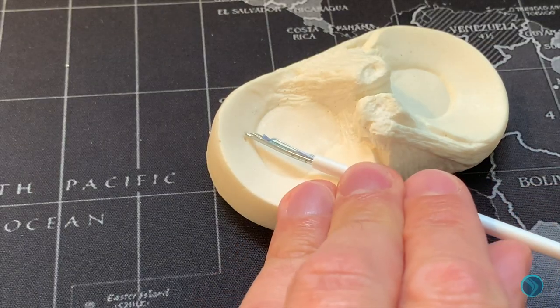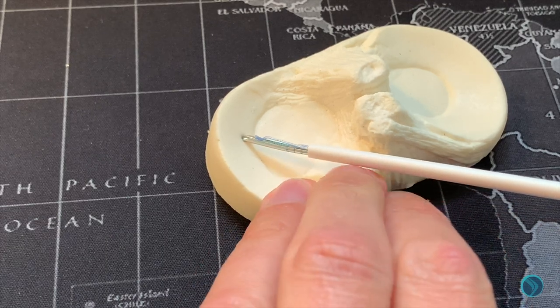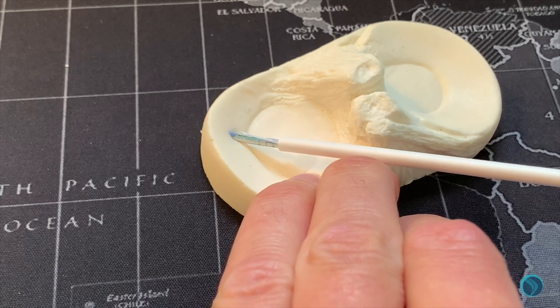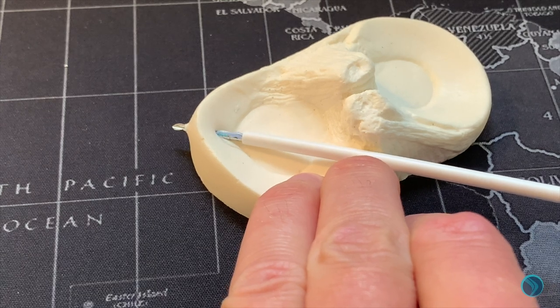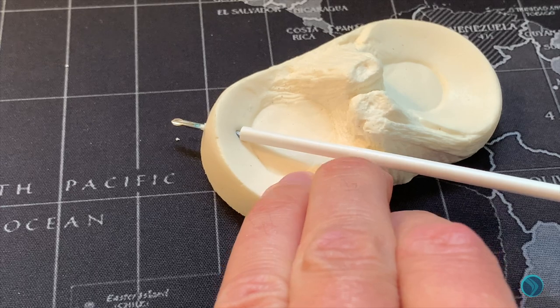Once you're happy with the depth that you want to penetrate, place the needle through the meniscus. A gentle wiggle helps to advance the needle, and in this model you can see it penetrate the posterior capsule.